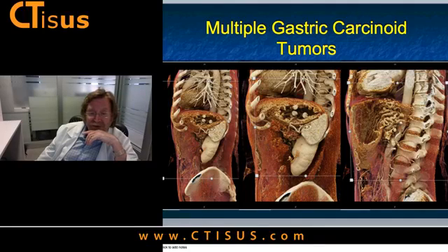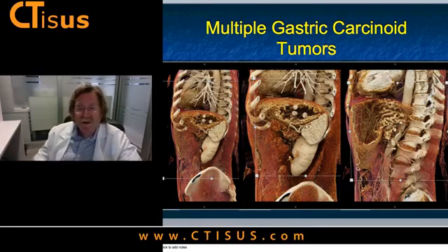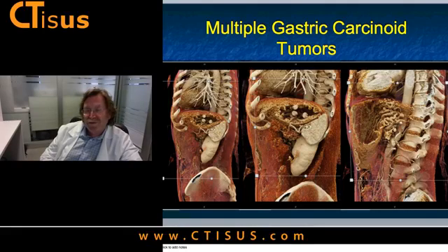Can cinematic rendering objects be artifacts in a radiology report, besides being a secondary capture? At this point, probably not, but there's no reason why it can't be. You can do image capture and then embed them in the reports. That's probably the easiest thing, and we can send videos. So I think you can probably do with the cinematic what you can do with any other imaging. One problem, and this is a more theoretical problem: when you make the videos, they're WMV files, and they run about 25 megabytes. And when I change them to Mac format, they become 80 megabytes. So they are kind of large. But I think that's just the way I do things, and it probably does not necessarily need to be done that way. Probably I'm doing it incorrectly, which is why they're getting so large.